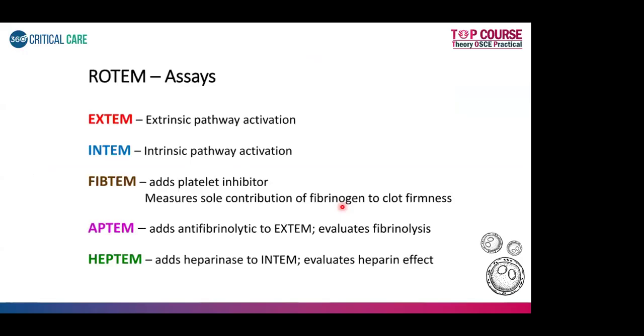So TEG also has something called heparinase TEG right now. Earlier TEG didn't have this, but the latest TEG has heparinase TEG. So again, you have to give heparinase there and then check the TEG. It will help you know. So it's not like it was not available at all in TEG. Even in TEG you can incorporate heparinase.